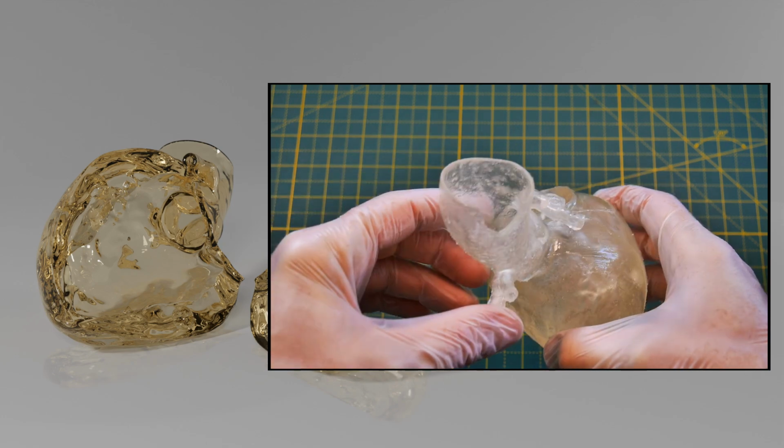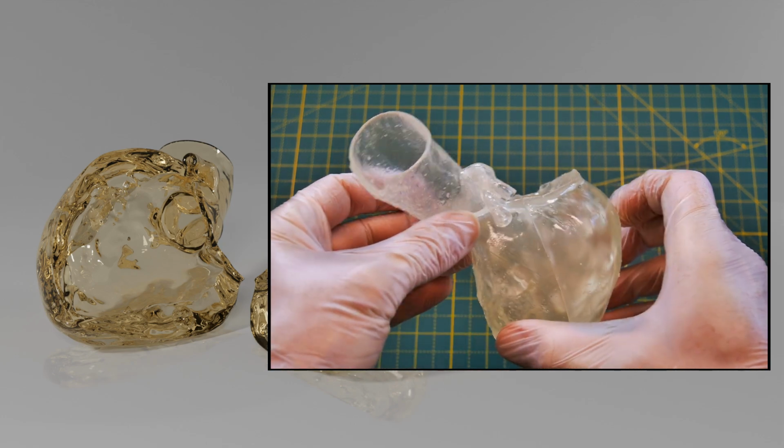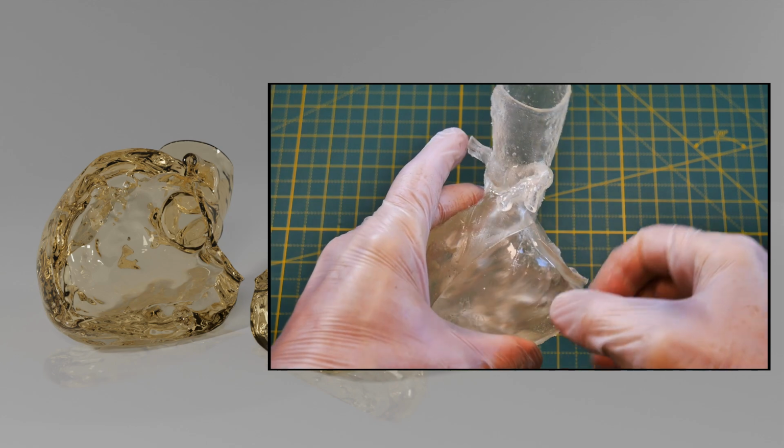The flexibility of the material enables the simulation of the balloon inflation and valve placement.